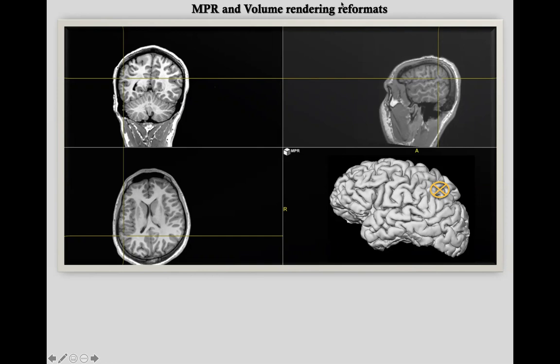So it's very helpful to sit with the neurosurgeon, and you can have 3D also on the 1.5 Tesla, you don't need the 3 Tesla. And you say to the surgeon, listen, you need to cut from here to there as far as you feel safe, because the lesion that we see on cross-sectional imaging corresponds to this shape. So when you sit with the neurosurgeon, you use the surface anatomy.